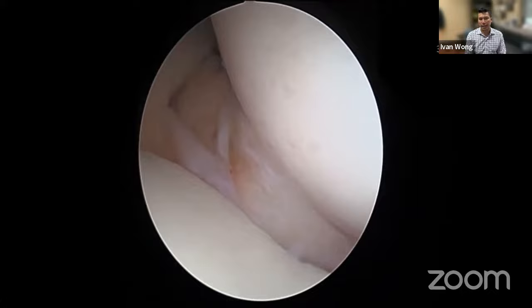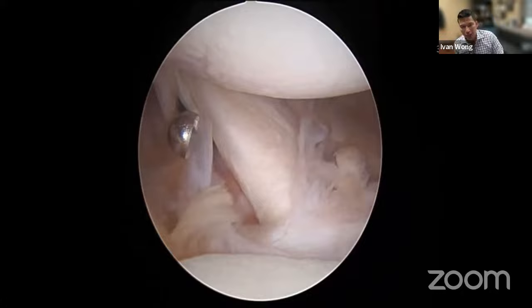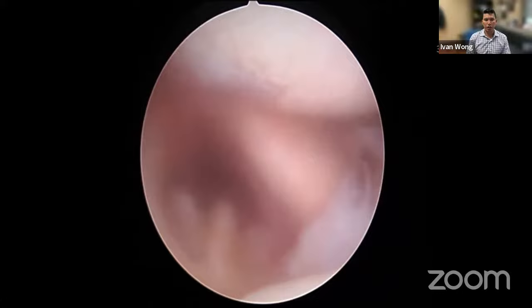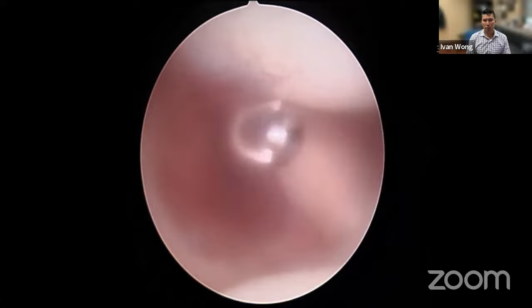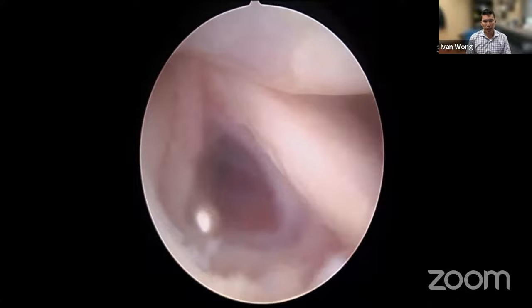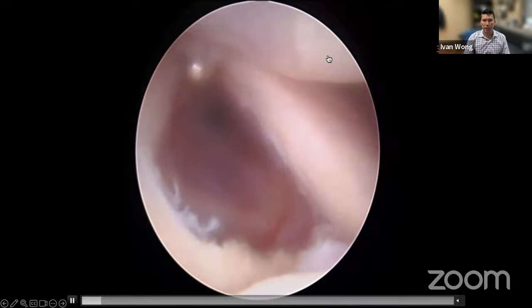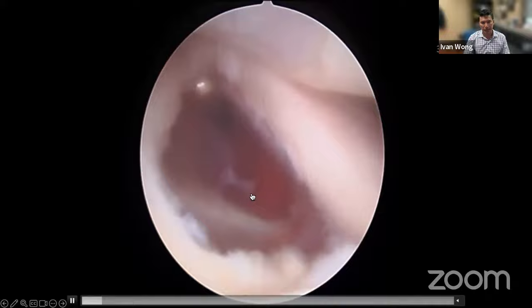The first step of performing an inferior-to-superior shift Bankart repair is to open up the rotator interval. The rotator interval tissue is extremely thin — the shaver is just barely doing suction here. We want to leave all the labrum untouched and open up the rotator interval to expose the coracohumeral ligament and the conjoint tendon. Pulling the head back, you can see the CA ligament — the muscle behind is the deltoid and pec. The deltopectoral interval is anterior to this.